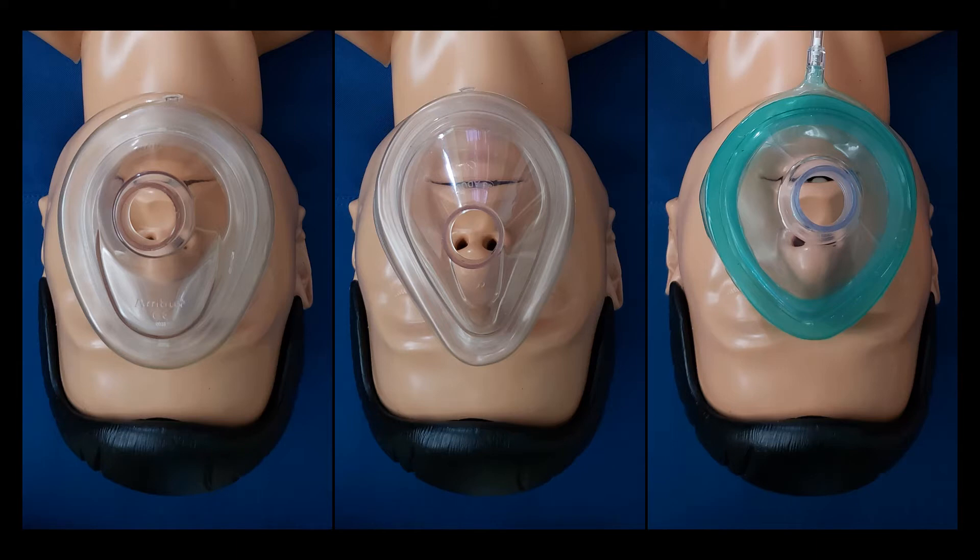Proper mask placement is essential to effective ventilation. The apex or angled portion of the mask should be over the bridge of the nose, and the bottom of the mask should land between the patient's lower lip and their chin.